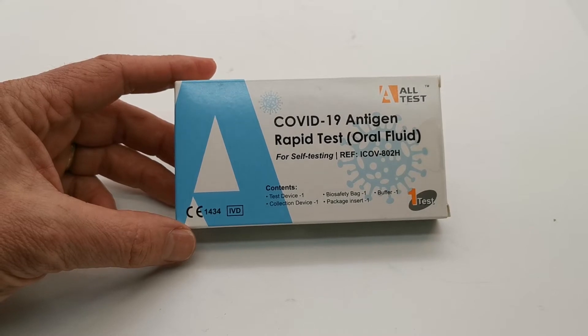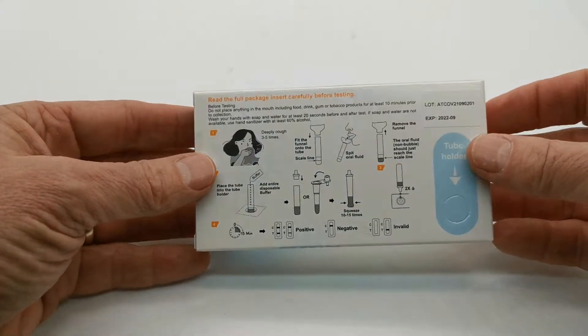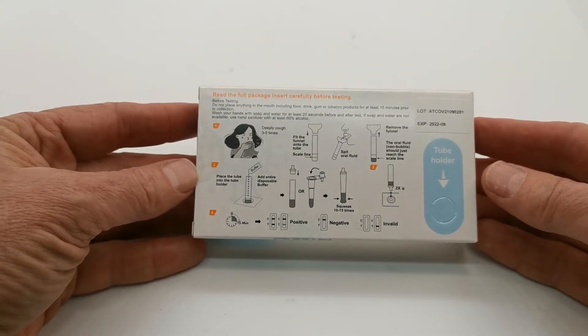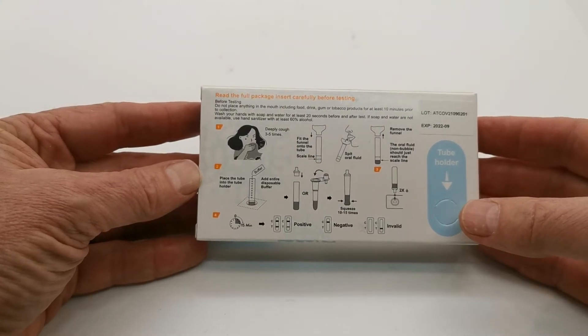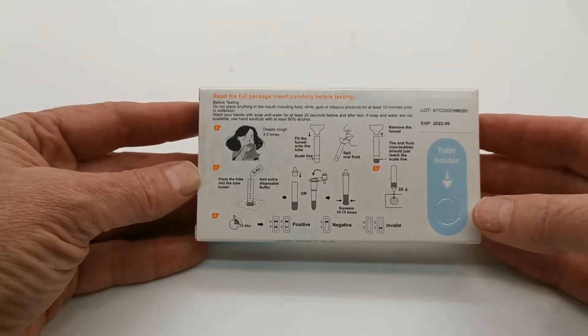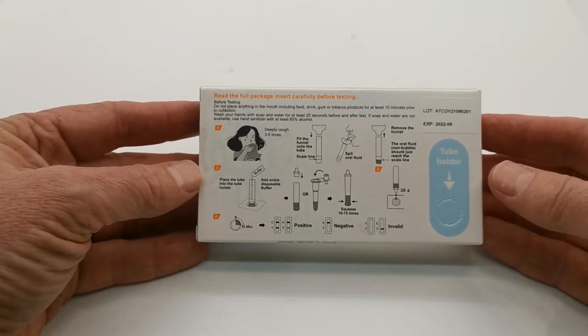This pack is intended and certified for self-testing. On the reverse, it comes with quick and easy-to-follow self-test guidance, and the box doubles up as a tube holder to actually run the test as a bench screening test.